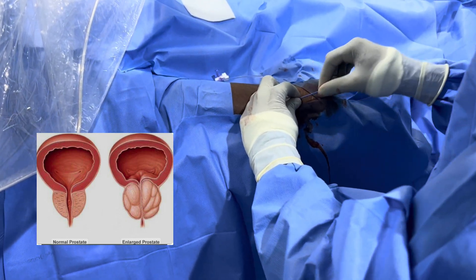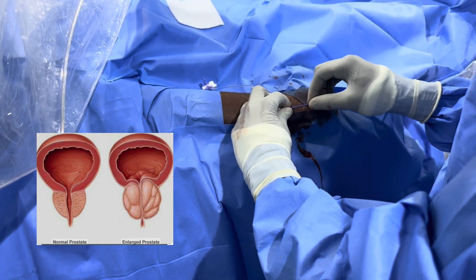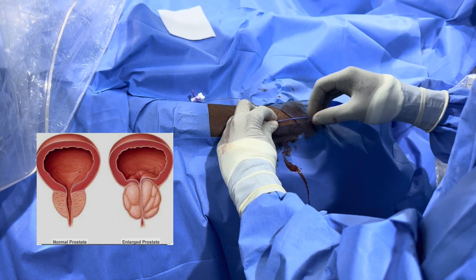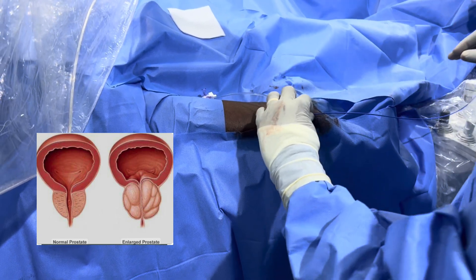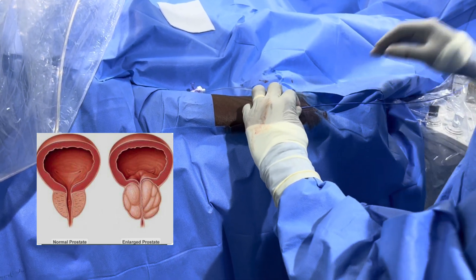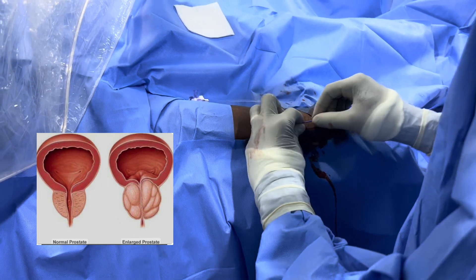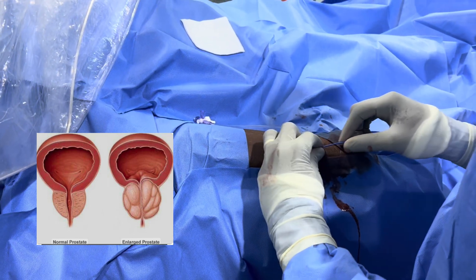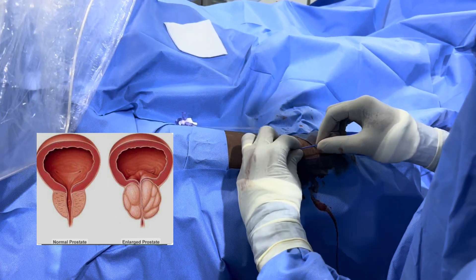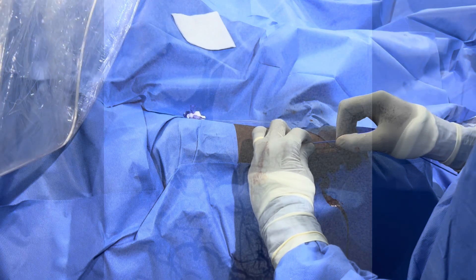As you can see, we've gotten access into the patient's wrist, and we're now threading a catheter that is going to go down from the wrist all the way down into the vessels in the pelvis. Basically, this is the only access needed to get the entire procedure done.